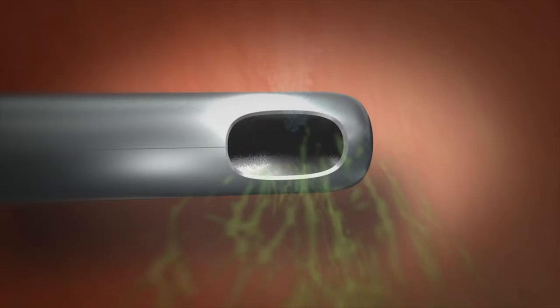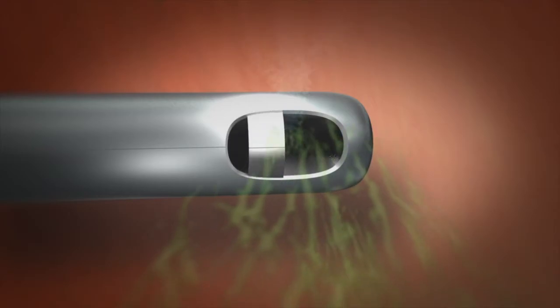The vitreous will therefore not have time to go back under the effect of its elasticity. Everything will happen as if two hands were each pulling in turn on an elastic band without letting the elastic band go backwards.